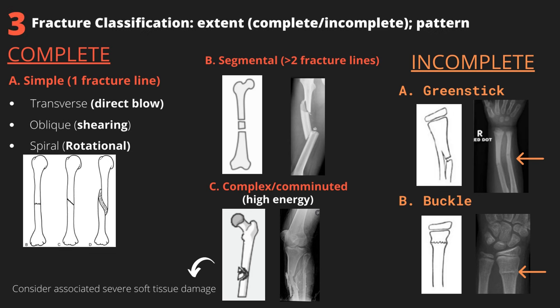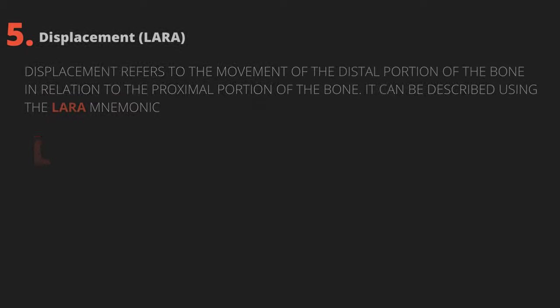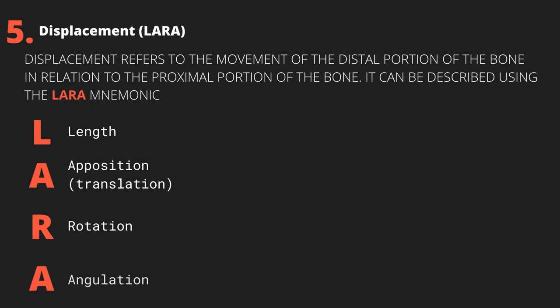Fractures can also be incomplete. Focusing on two common in the pediatric population: greenstick fractures occur when the bone deforms without breaking completely, made possible by the elasticity of children's bones; and buckle fractures occur when the cortex of the bone buckles under a compression load, but there is no loss of continuity or deformity of the bone.